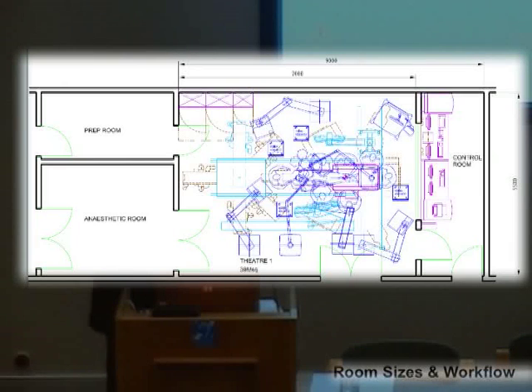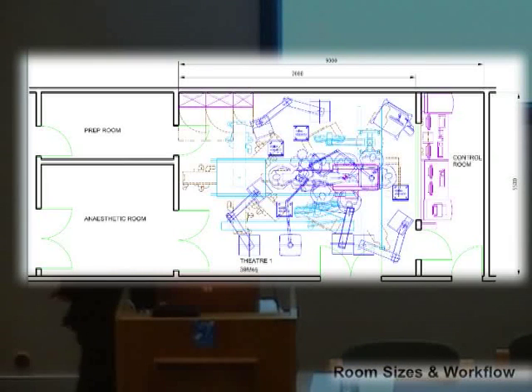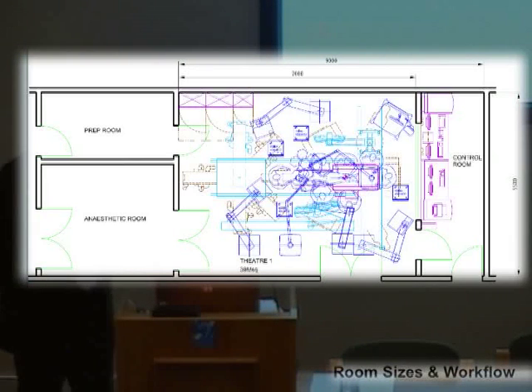If you want all the bells and whistles with this system, you're going to end up with a control area of that sort of size, which is quite large, but you can't avoid that. The C-arm position. In an OR environment, the C-arm needs to be parked well out of the way of the operating table. If you can't park the C-arm out of the way, the operating table really becomes useless. So we need to get that as far as we possibly can. So consideration needs to be where we park the C-arm. You can see the light blue up here is basically the C-arm position in its park position, but it's now directly in front of the prep room door.